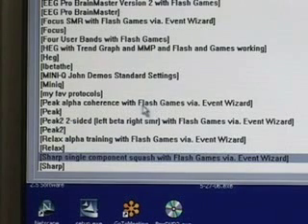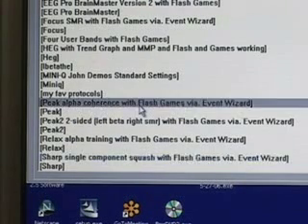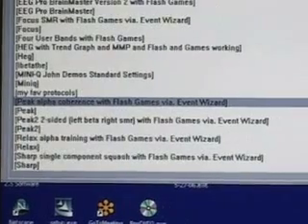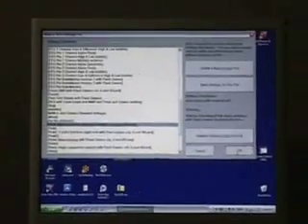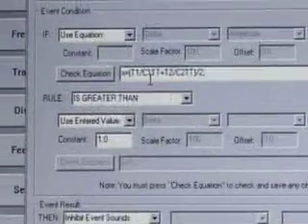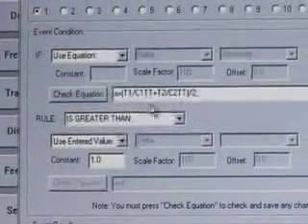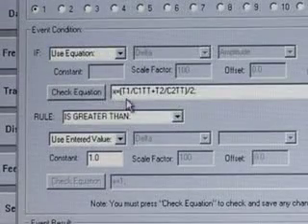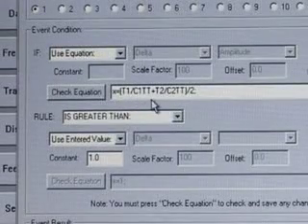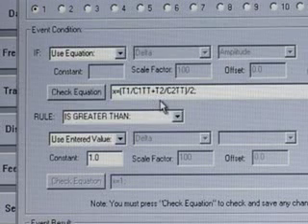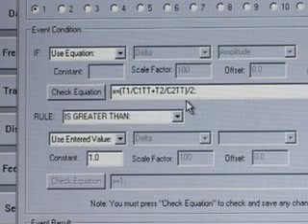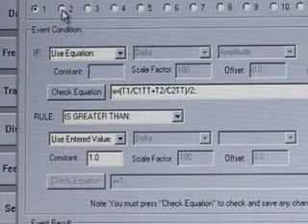Let's look at the alpha coherence protocol to see how that one was managed. We'll read in the settings and look at the event wizard. We see that the event wizard has been used to design ratios — for example, theta 1 divided by channel 1 theta threshold, plus theta 2 divided by channel 2 theta threshold. So even though we're doing coherence training, we're also watching the theta values.